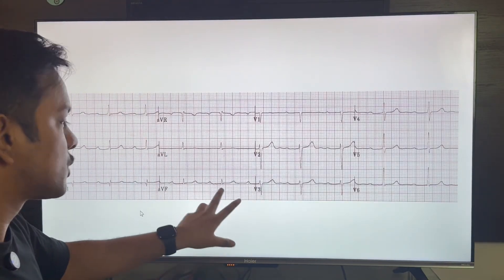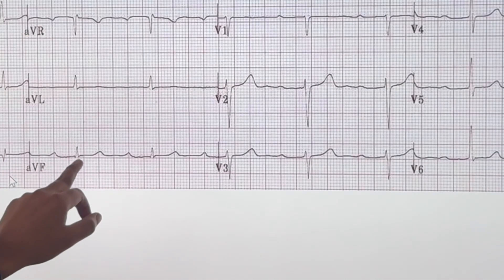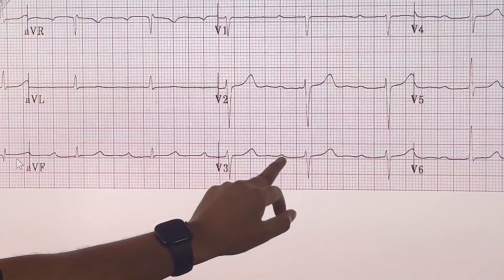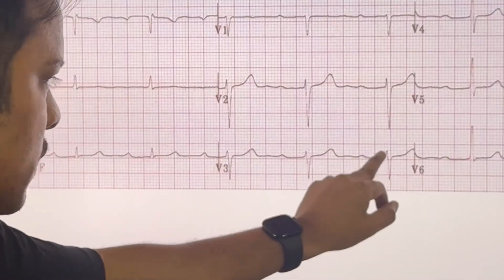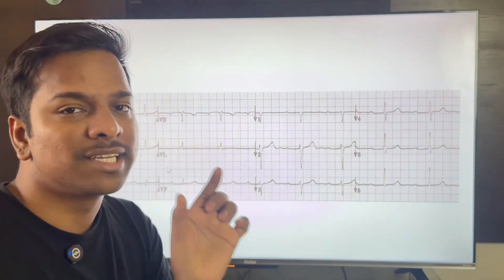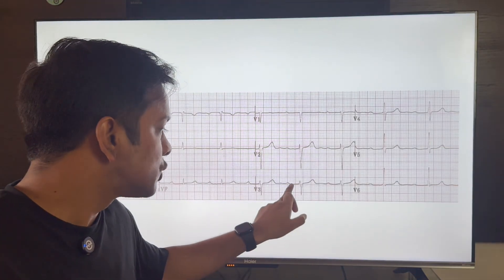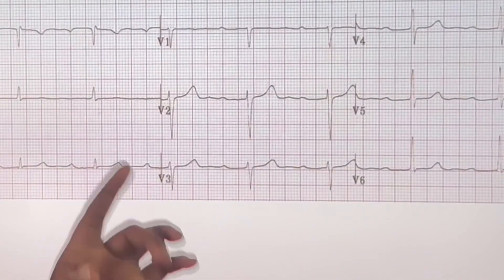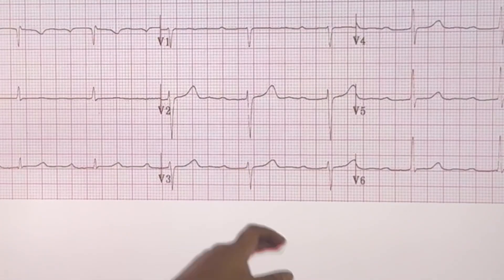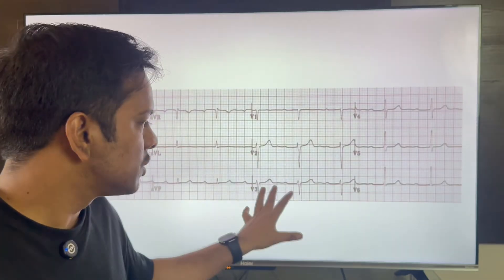In the next ECG, let's check if it's sinus rhythm. We can see P waves followed by QRS complexes consistently throughout. This is typically a first degree heart block — there is a huge distance between P and QRS. Normally the PR interval is 0.1 to 0.2 seconds, but here there are more than five small boxes — about six — so this is first degree heart block, which can be managed conservatively.